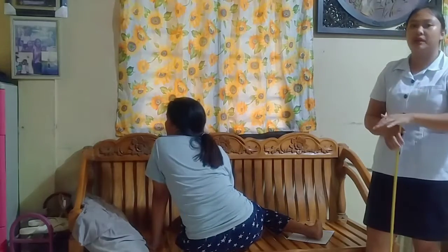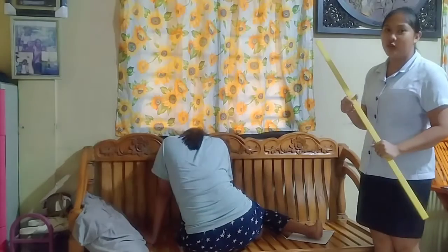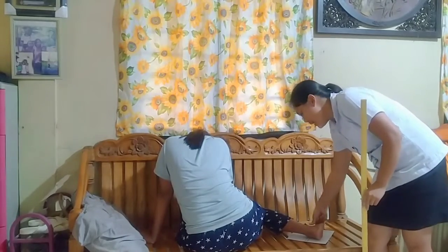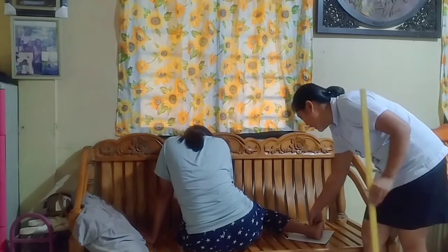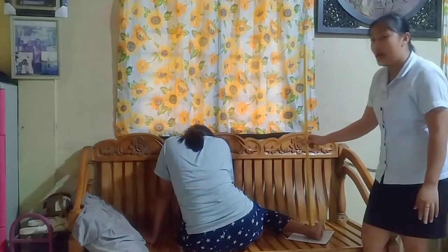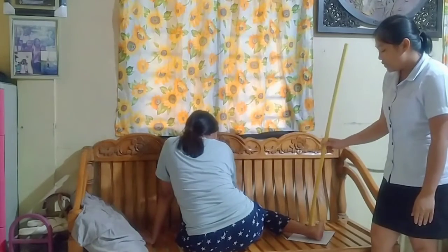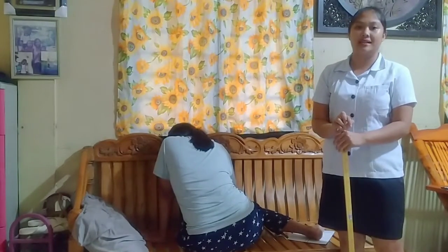This projection will be harder than the mediolateral. The central ray will be perpendicularly directed 1/2 inch superior to your lateral malleolus. So, i-measure po natin 1 inch, kunin po natin ng half, dito po natin kukunin, dito po, magdadirect ang ating central ray. Yan. So, this projection shows the superior aspect of the calcaneus.